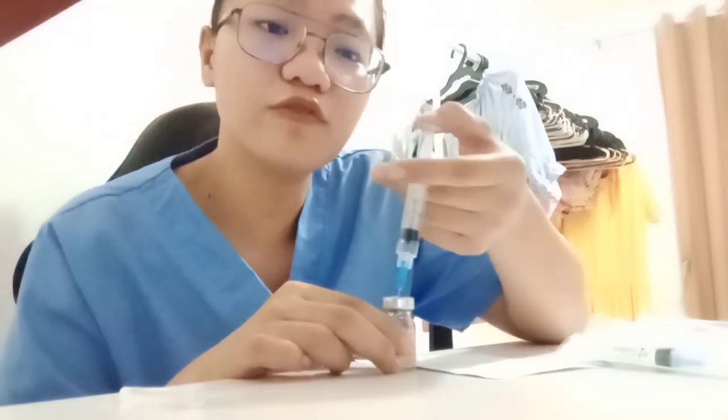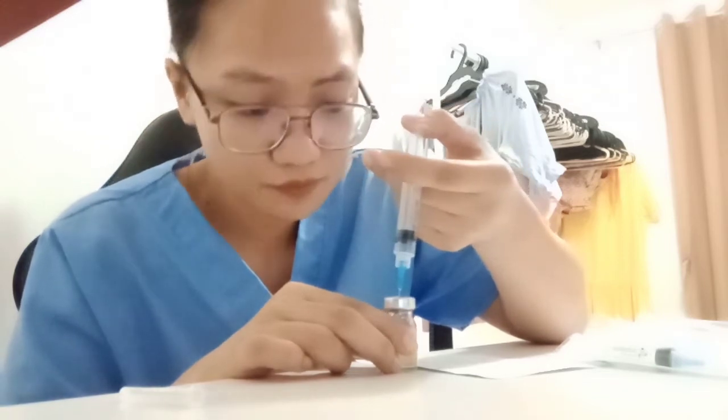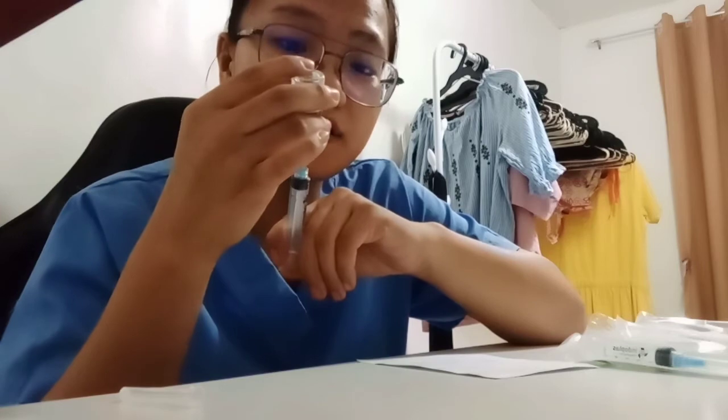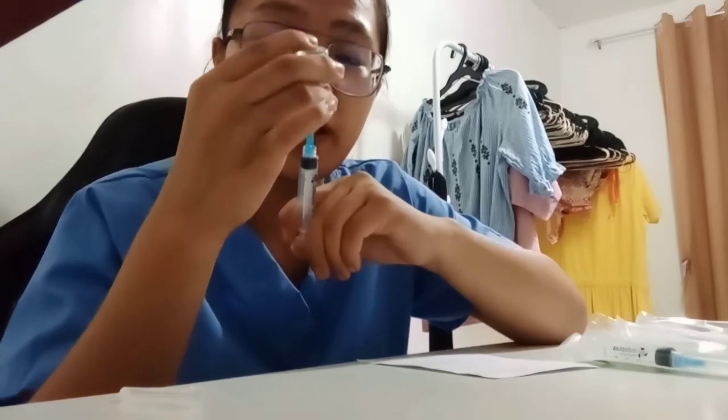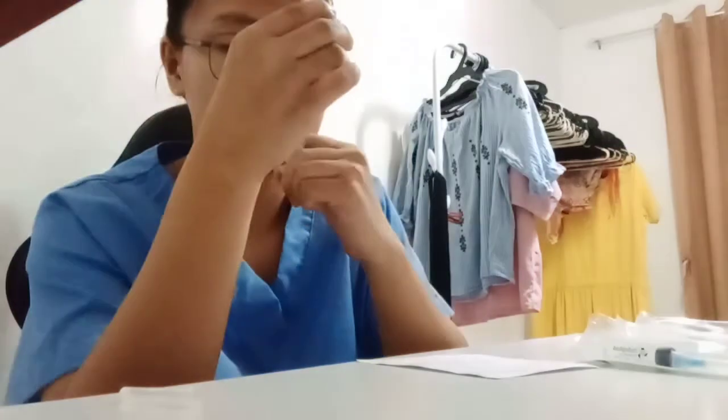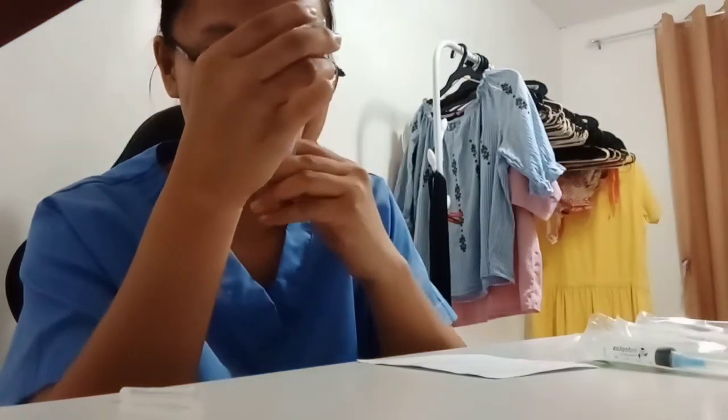Next is to carefully inject the air. Next, hold the vial and the syringe and draw the amount of the medication. The air that I drew earlier is 1 cc and the medication that I will get is also 1 cc.